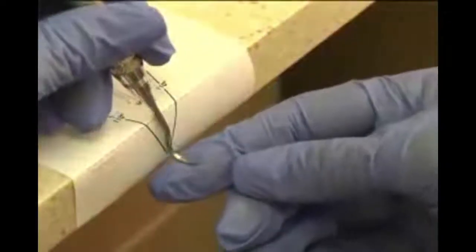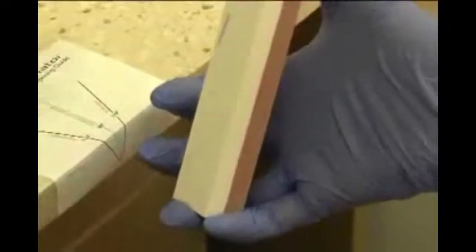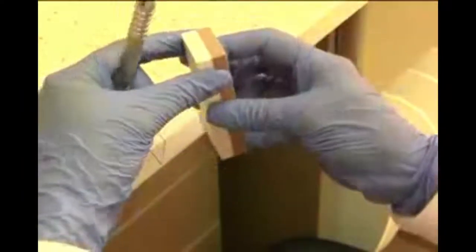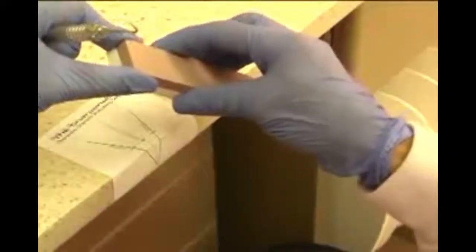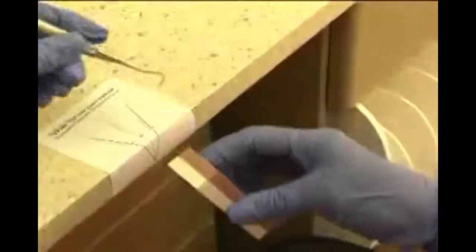So now we will do the other side. And I'm holding the stone the same way. I've seen a lot of people try to hold the stone like this, and try to break that habit, because when you hold it like this, you're not applying equal pressure to the stone, and also you can ruin the toe of your instrument, and you have a hard time manipulating the stone around the toe. So it's a good idea to have your thumb on one side and your fingers on the other, holding it so that there's still one third of the stone that's free. You're not up here like this, you're holding it down just a little bit.